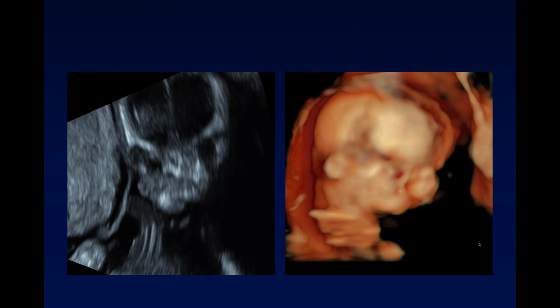This is an example of a fetus where in the process of doing your early anatomic scan, you can look at the face and see what catches your eye. Here you can see one normal eye. Look at this eye. You can never make out the orbit. And if you look in this modified 3D rendered view of the face, you can see this fetus has a large cleft extending up to the orbit, possibly from this structure here, which is an amniotic band. This fetus has a negative cell-free DNA, but has a major abnormality that was able to be detected at 13 weeks gestation.